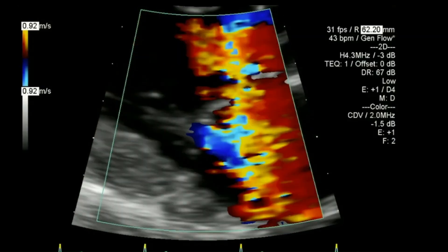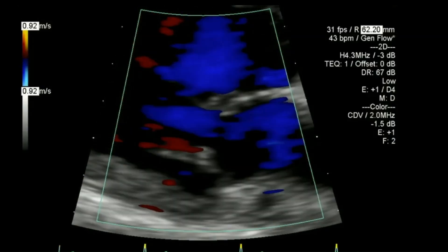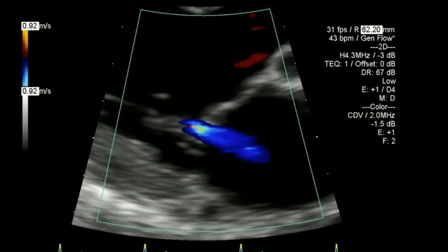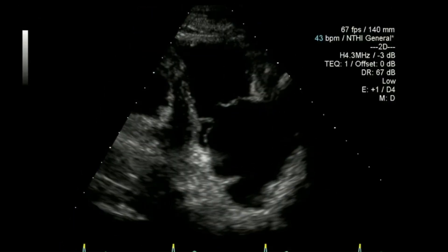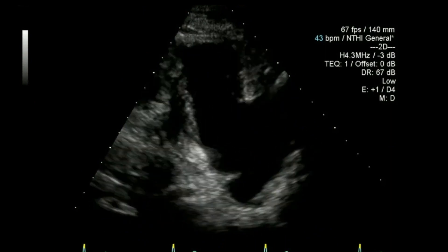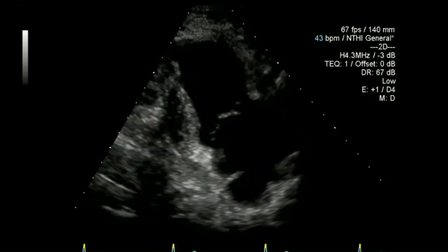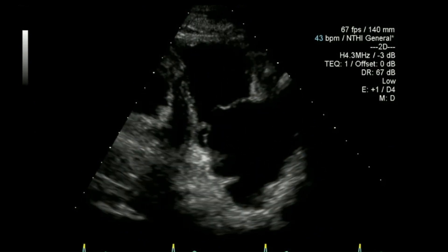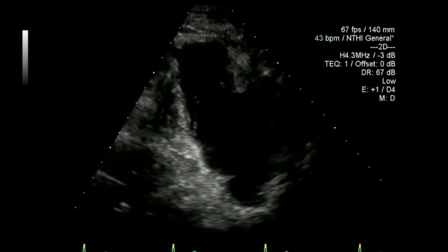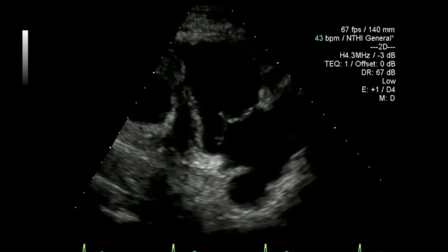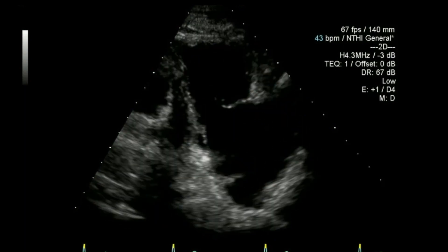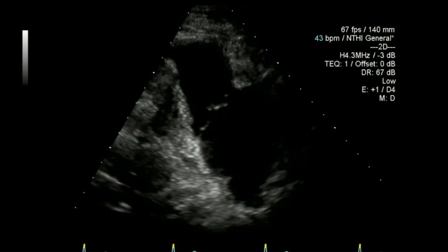There's a little bit of mitral regurgitation so I'm trying to maximise showing it in the window. From here I move to a right ventricular inflow view — I've narrowed the sector a little bit because when I put the colour flow on I don't want my frame rate to go too low.